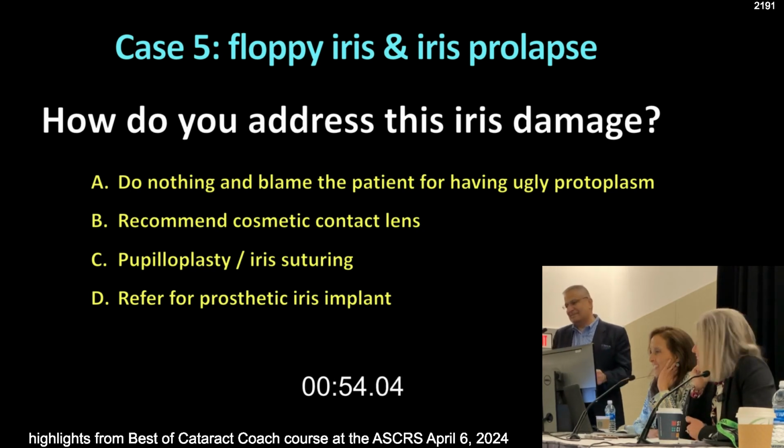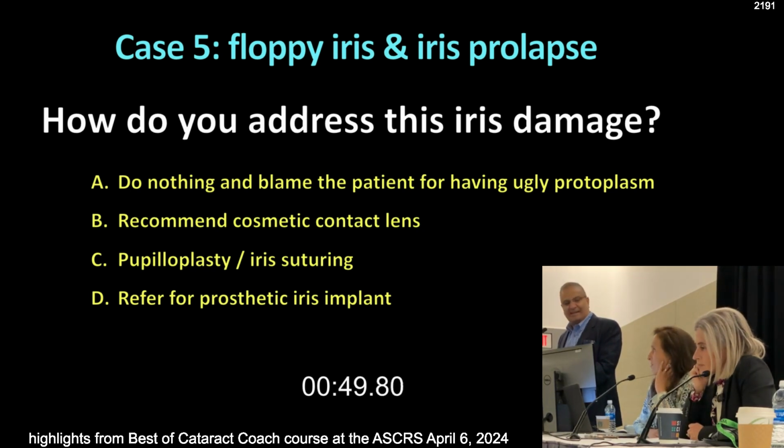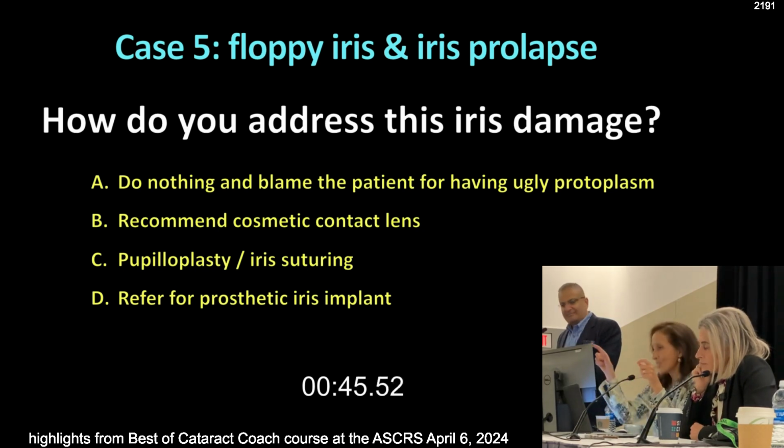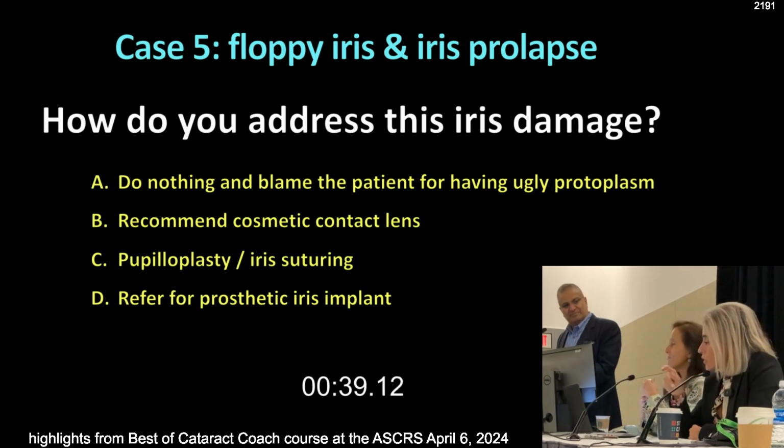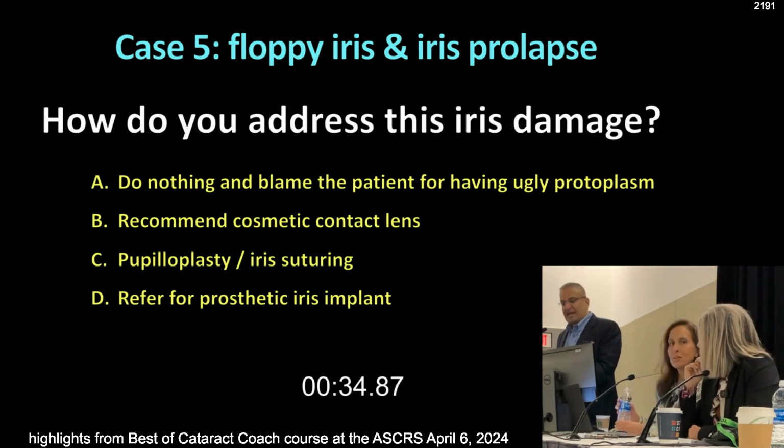Hey, I know that one. Recommend a cosmetic contact, pupiloplasty, iris suturing, refer for prosthetic iris implant. Yeah. Pupiloplasty would be great in this case. You can just close that up. The patient will be super happy. I think it'll work great. Yeah, if you've got enough tissue there to cover up all the little strands. You'll be a hero.